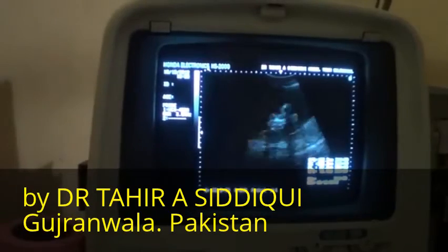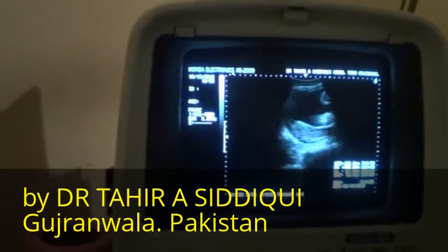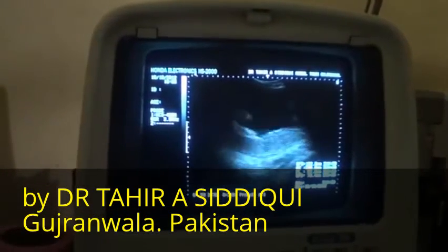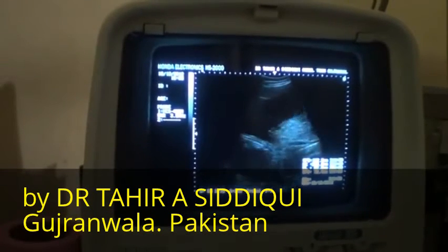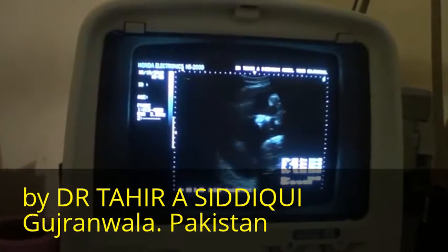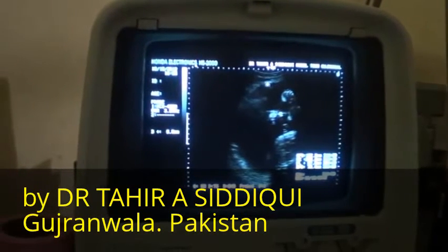Low-lying placenta, posterior wall with hyperactive fetus that you will see with the passage of time, as I will show you later on. But first of all, let's see how much the largest amniotic fluid pocket measures, excluding the umbilical vein.